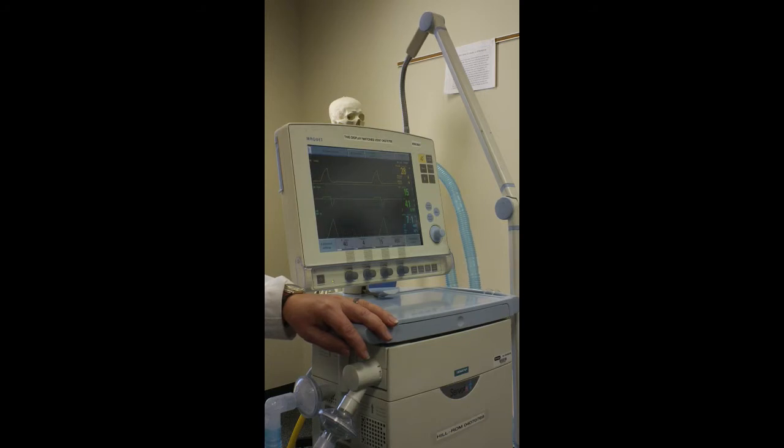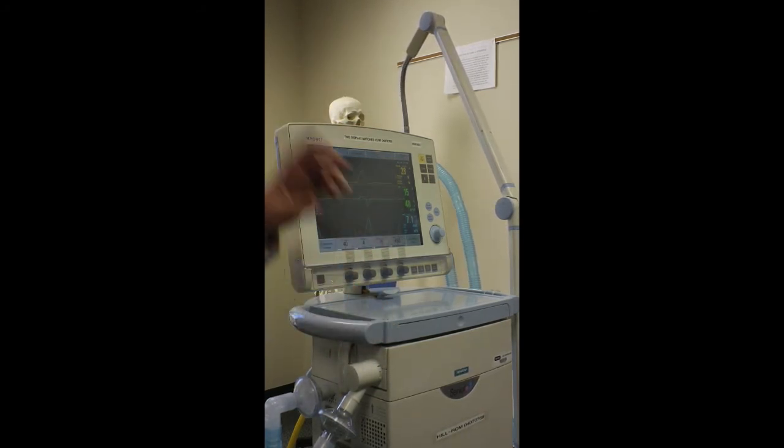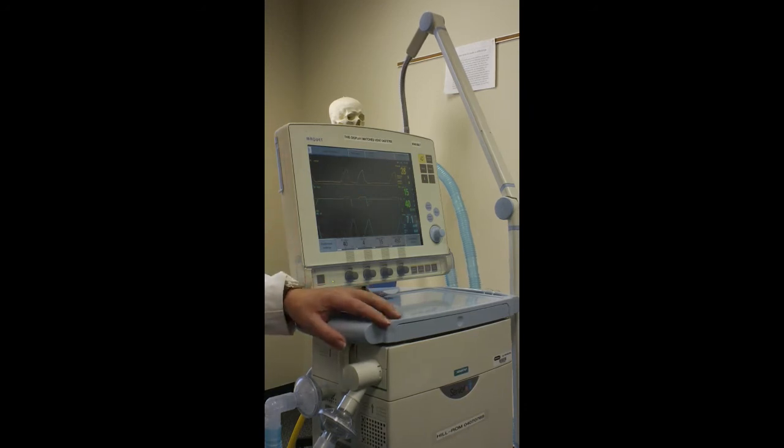You said the pressure's too much? His peak pressures. You're in volume control, and it's taking 35 to deliver that breath. The doctor wants you to do something about that because he's worried the patient's going to get a pneumo. Lower the peak. Drop the peak. Nope, I need the PEEP that I have.